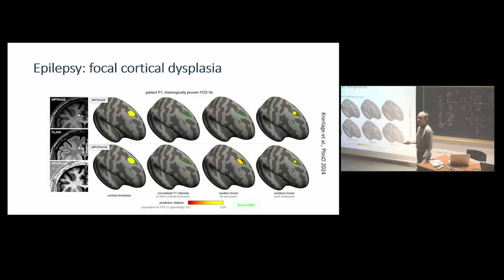You can also use it for some clinical applications. So you can say, okay, how thick is the apparent cortical thickness in focal dysplasia? Focal dysplasia is a type of epilepsy where you are not capable of actually finding the spot which causes the epileptic seizures of these patients. And after some time, these patients can no longer be treated pharmacologically, and that's an issue.